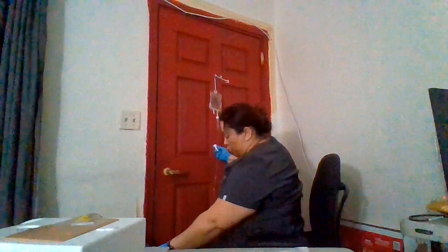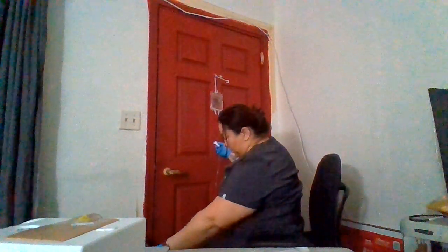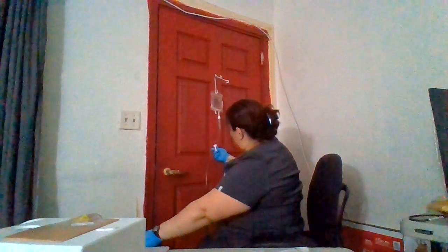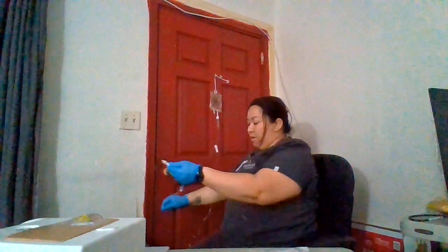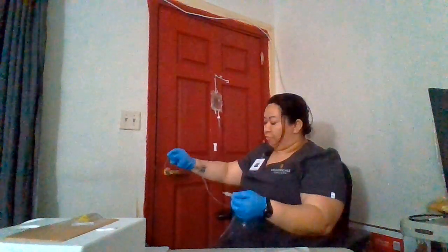And the goal is to remove all the air bubbles that we might have in our line. So our primary tubing is now ready.